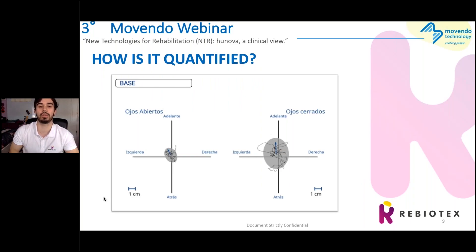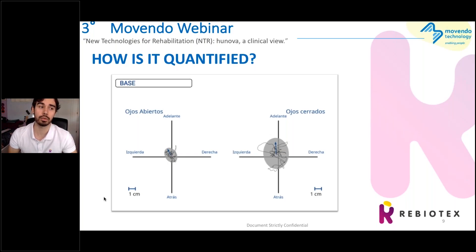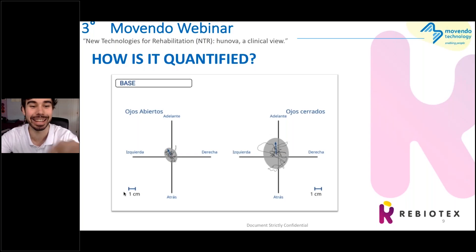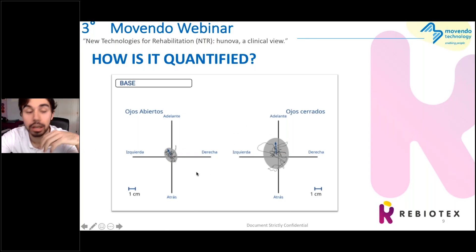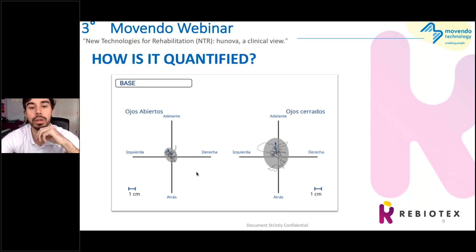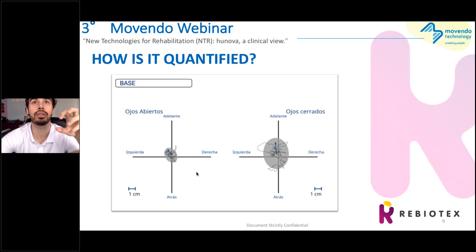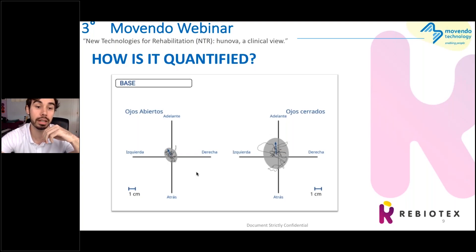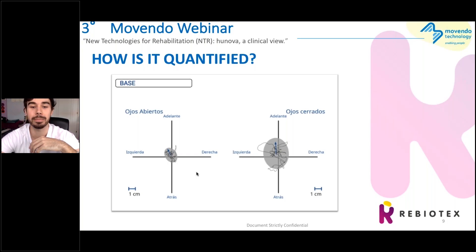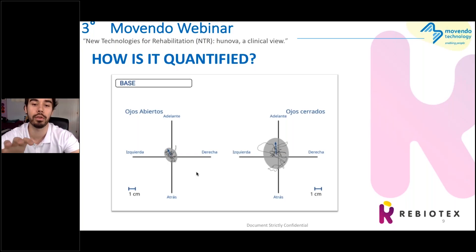Now I would like to show you some real patient graphics. These belong to a Parkinson's patient. This exercise asks the patient to keep a standing position while the platform is unstable for 30 seconds. The left graphic is with eyes open, the right one is with eyes closed. The black line shows the trajectory during the trial. The gray circle is the mean area covered during the eyes open and eyes closed exercise. As you see, with eyes closed we are not using the visual system for balance, so the parameters are worse compared to eyes open. We will see later if this is normal for this patient or not.